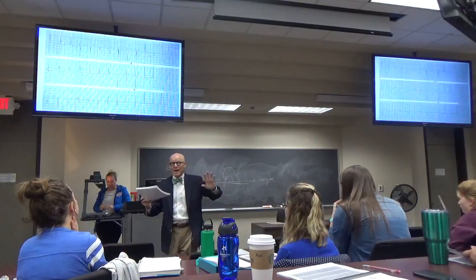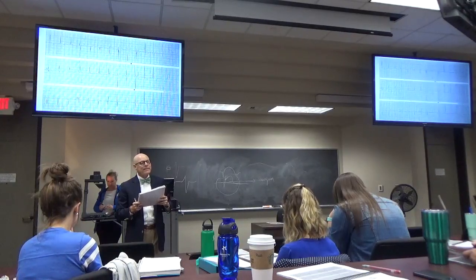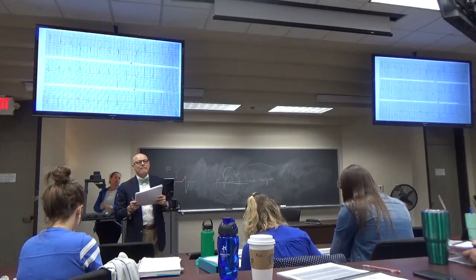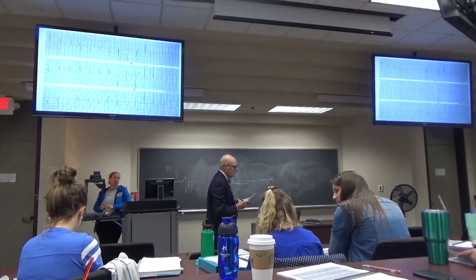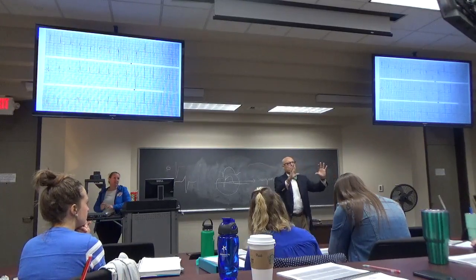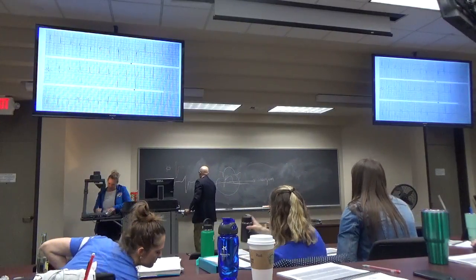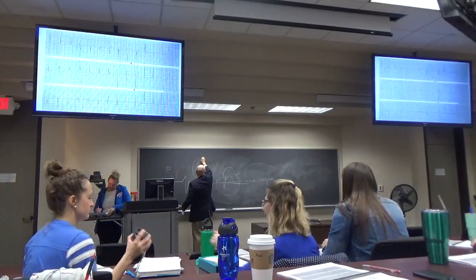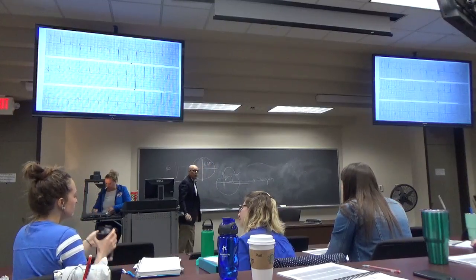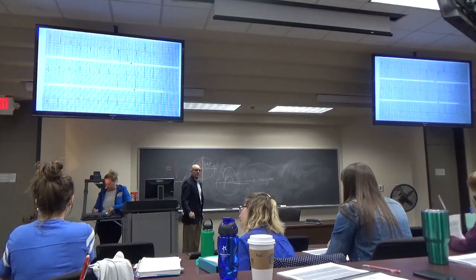Doesn't matter, it's okay. I just want to clarify, I got negative 25 when I actually drew the axis. Is anything below negative 30 considered LAD? No, it depends on the criteria you're using. When Jacob lectured, he used that entire quadrant, and a lot of cardiographers do that today. They use that entire quadrant as left axis deviation. So even if you had a minus 10, they'd say that's a left axis.